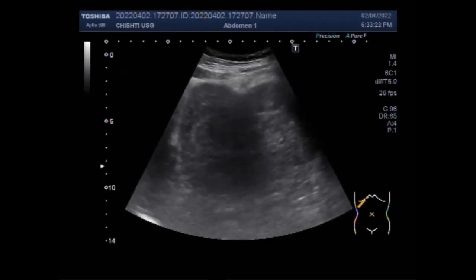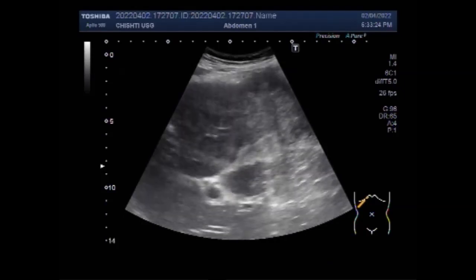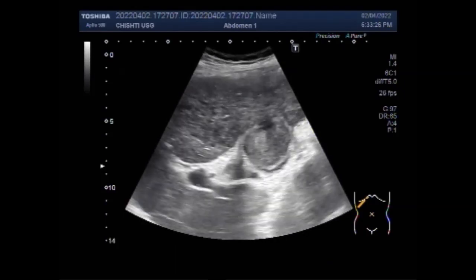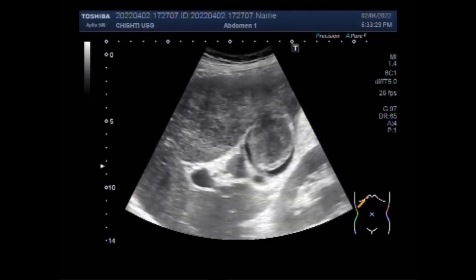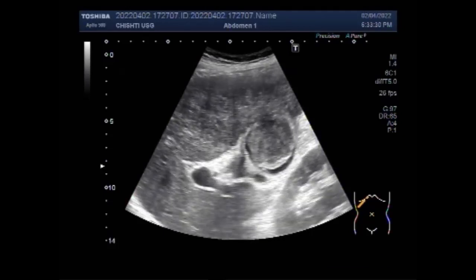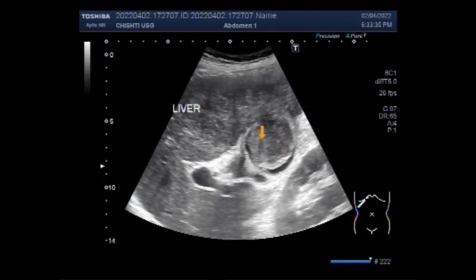Ultrasound can depict a focal intraluminal wall involvement or large mass-like lesion replacing the gall bladder. Abdominal ultrasound pictures of the gall bladder and bile ducts show signs of inflammation or indications of blockage of bile flow.